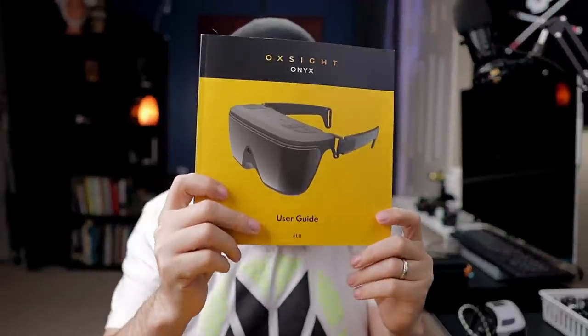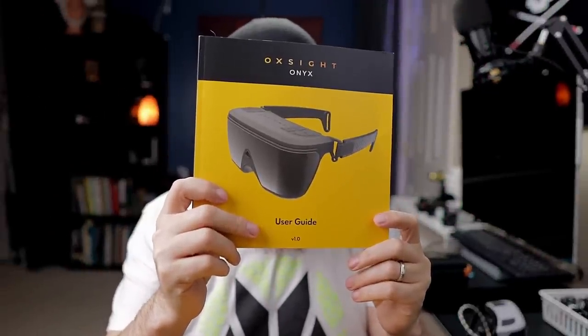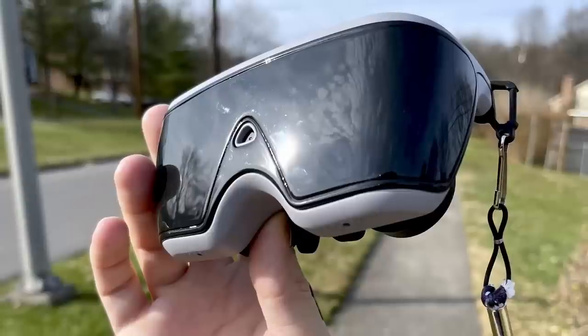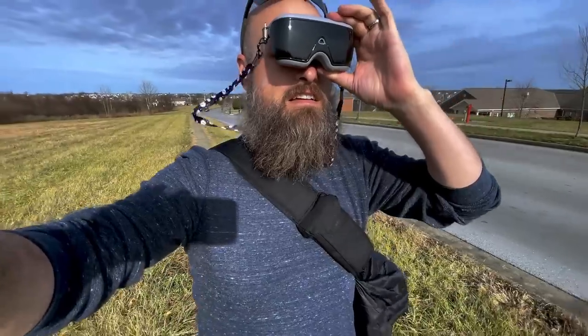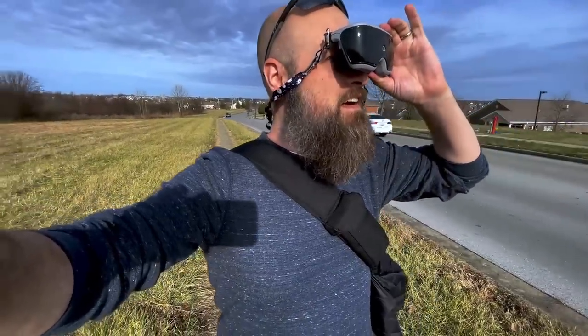So like I said, this is a brand new wearable hybrid. It's called the Onyx and it's brought to us by Oxsight. The Blind Life is one of the first channels to feature it in the US, which is really pretty cool. It's a lightweight and much more affordable wearable device that hopefully will get a lot of people into the wearable market.